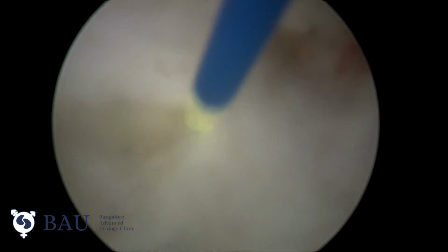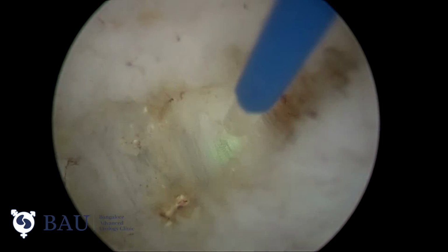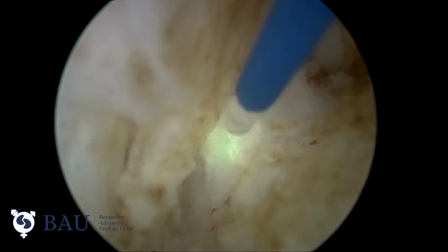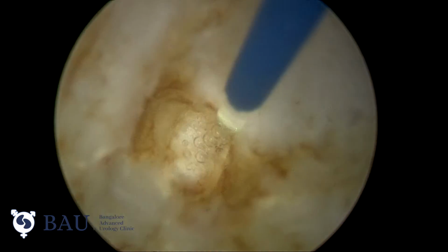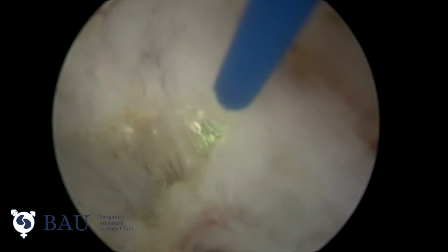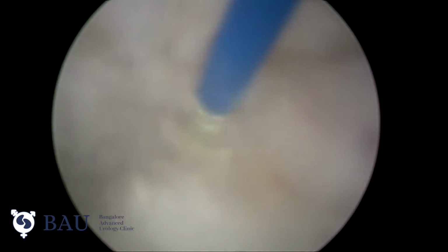In some places, where the patient had early prostatic infection, we may find difficulty identifying the plane. In that scenario, we have to go where the plane is very good and cut through the tissue in the adhesion area.